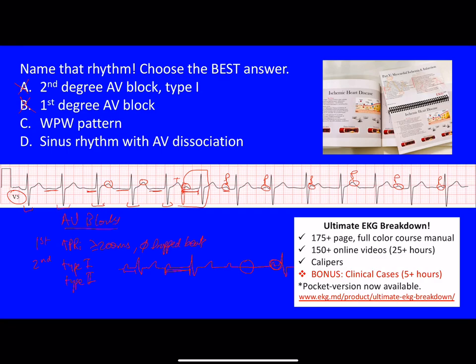With Mobitz Type 2, second degree AV block, we have complexes with a PR interval that stays constant, and then we have dropped beats that occur sporadically — meaning there's no pattern whatsoever. Unlike Mobitz Type 1 where we saw prolongation of the PR interval, here we just have complexes with a P wave and then all of a sudden a dropped beat, but there is no pattern to it whatsoever. That's Mobitz Type 2 second degree AV block.